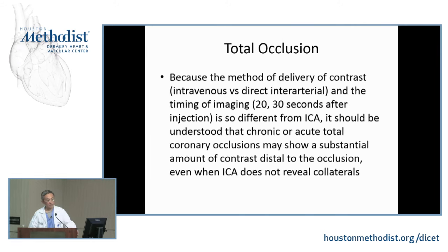Okay, I think with Dr. Alpeshah doing a lot of CTO, this is becoming a more important question. When you see a totally occluded vessel, I want you to pause this for a second. Think about the image we see, right? We give about 50, 70 cc of contrast through the vein, all right? And you're able to see the image that we see.